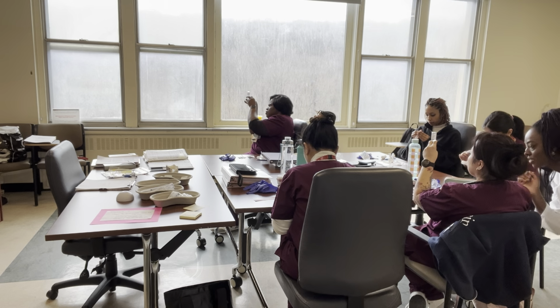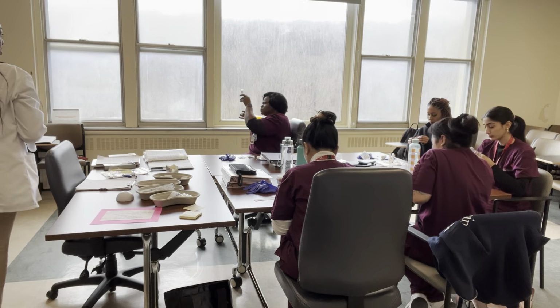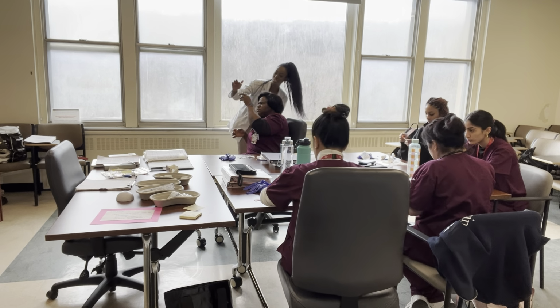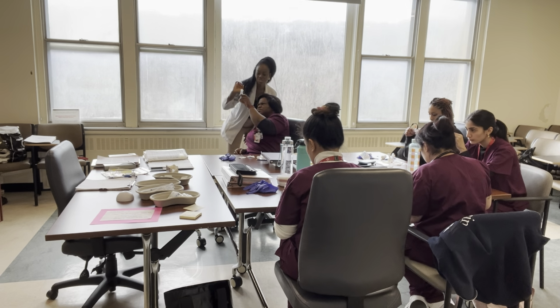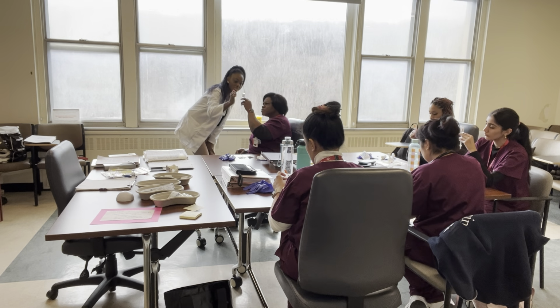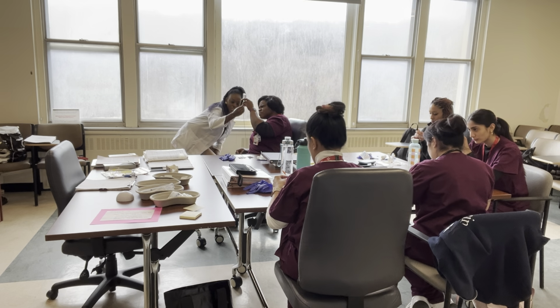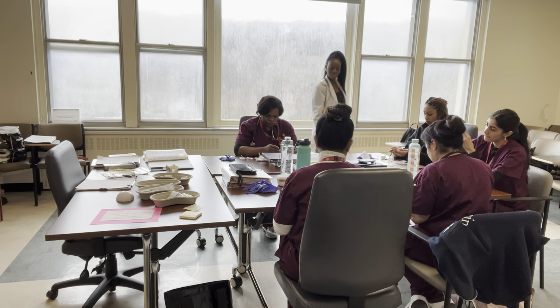And then you have 12 units. Good. You can put the cap on. Good job. That's yours. So this is the top of insulin. I'm looking for, sorry, the expiration date. I don't see an expiration date on your vial. You didn't. Beautiful. Now it is. And then the date that the vial expires, 2027. Good job. And then now I see that you have 11. Is that correct? Yes. Good. So now you can put the cap on.